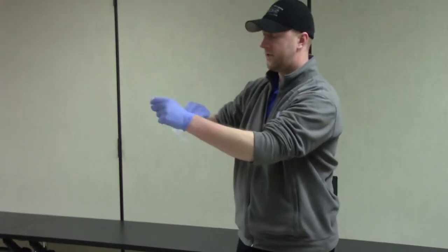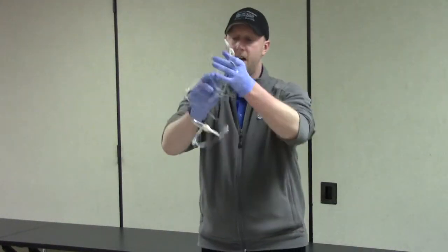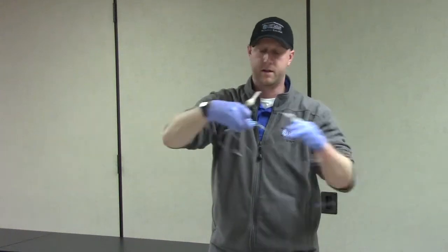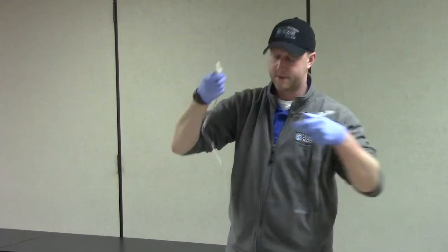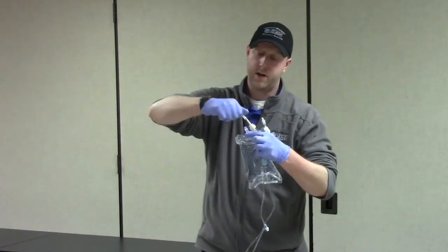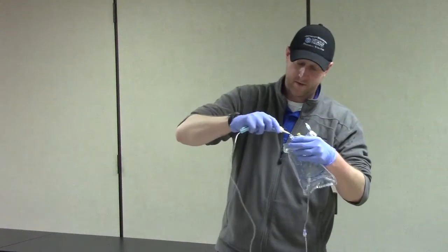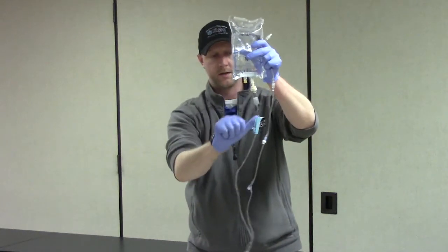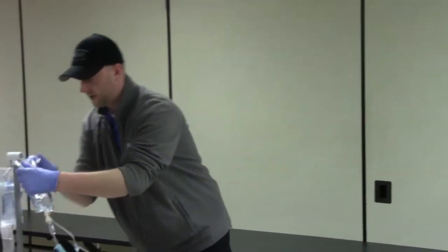I'm going to do the same thing for my drip set — open it up and look at it to make sure it's not discolored or yellow. Everything looks good. Then I'm going to take my roller clamp and pull it all the way up towards the top, so that it's a couple inches below the drip chamber, and then close off that roller clamp. When spiking a bag, we want to use sterile technique — when I pull the caps off, I don't want to be touching the spike or the end of the bag. We're going to insert the spike with a twisting motion into the bag, turn it upright, squeeze the drip chamber a couple of times so it's about half full of fluid, and then set it on the IV pole.